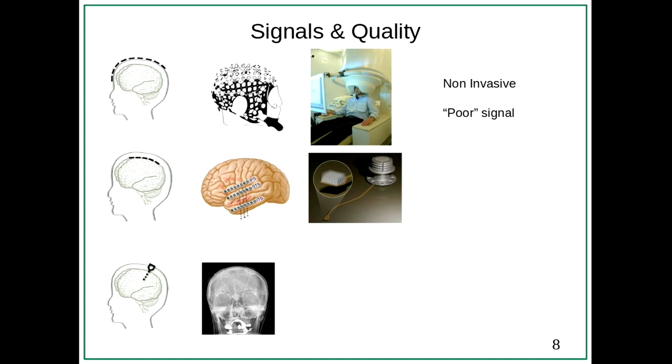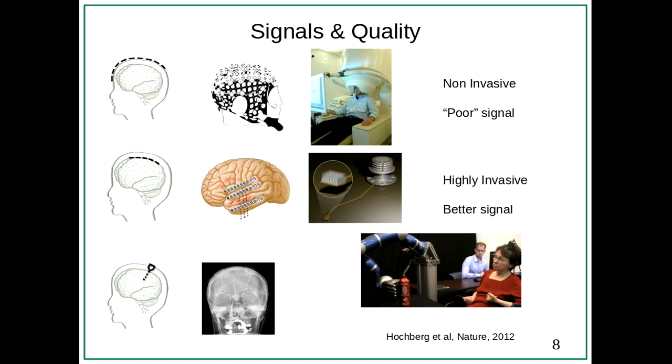Other methods used in BCI research measure inside of the brain. It's a little bit more invasive because you need to open the scalp and actually put electrodes on top of the cortex or deep inside of the brain, or you put a microelectrogrid on the motor cortex. That is like the picture in the middle over there. Especially with that method, you have a high fidelity signal. Because you have so many tips, you have so many signals, you can do really cool experiments like exerting real fine grain control over a robot's arm.